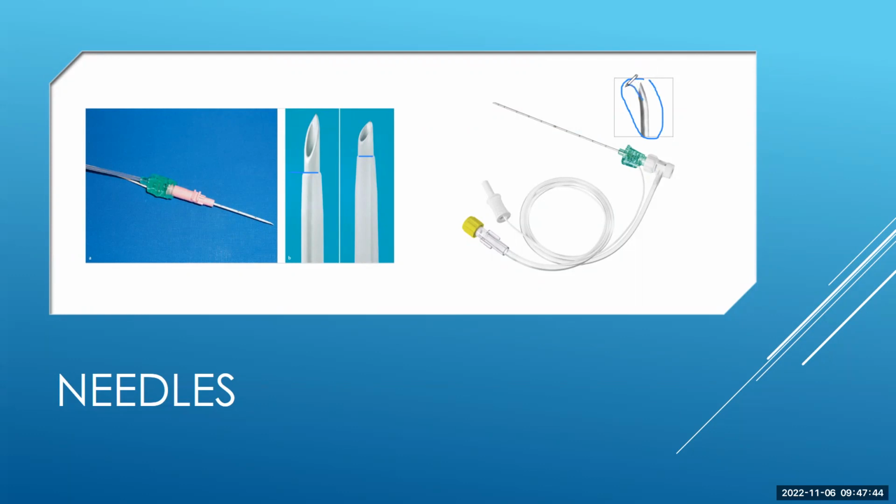Then when we place a catheter, the catheter comes out in that fashion. I do a lot of continuous plexus anesthesia. I probably place anywhere from 8 to 10 continuous peripheral nerve catheters a day. So I'm more accustomed to the Tuohy tip needle, but we also do single injections, normally paired with our continuous plexus anesthetics as well.